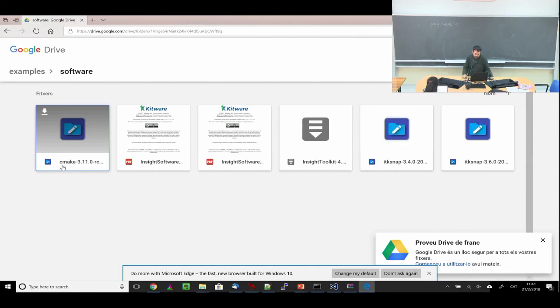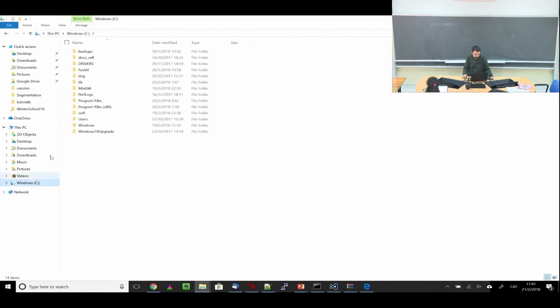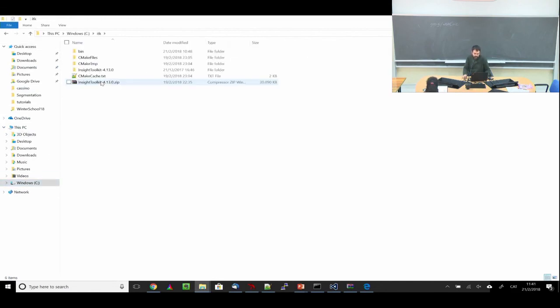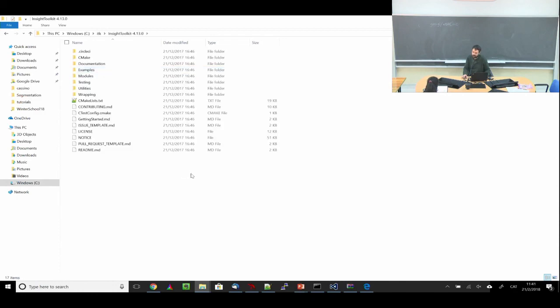Okay? So you can start downloading this and installing. Install CMake, if you already have it, install ITK-SNAP, and download the ITK zip files, okay? You can do whatever you want, but I would suggest to put them into something like C:\ITK. I'm talking about the source code, okay? Here, and then once you extract, it will create this structure.